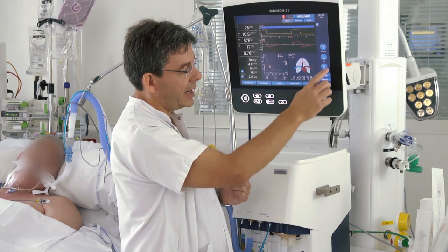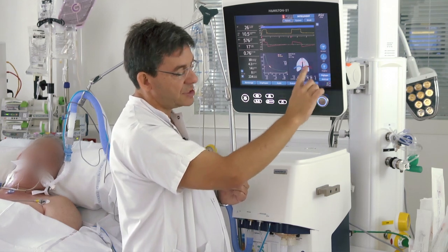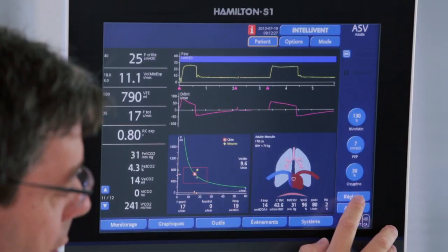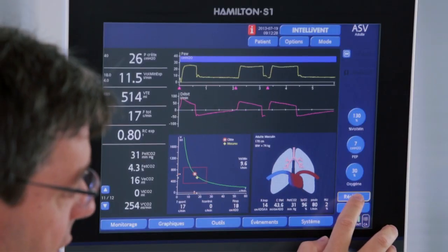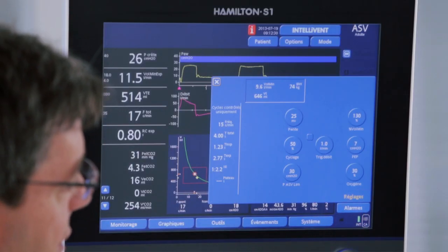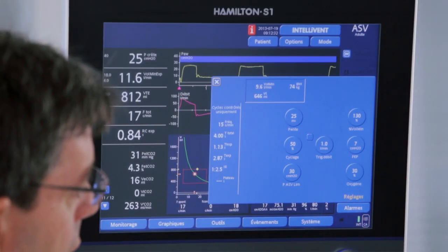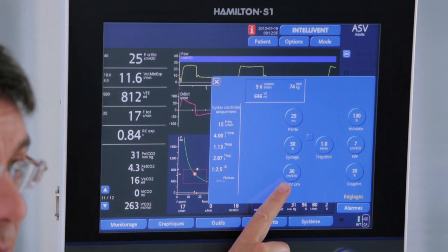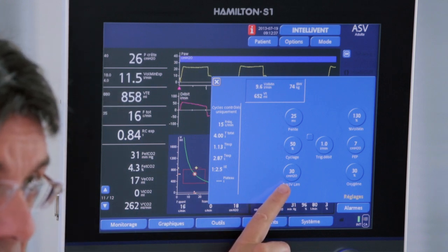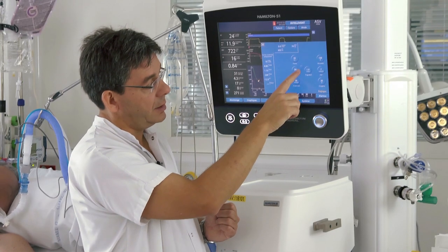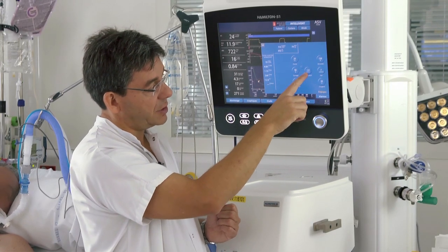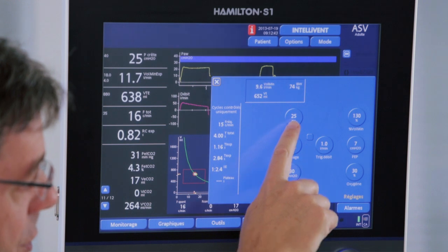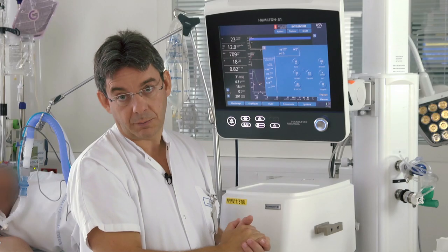In ASV, the oxygenation parameters PEEP and FiO2 are manually set, and in the settings we also have to set the maximum pressure limit, the inspiratory trigger, expiratory trigger, and pressure ramp.